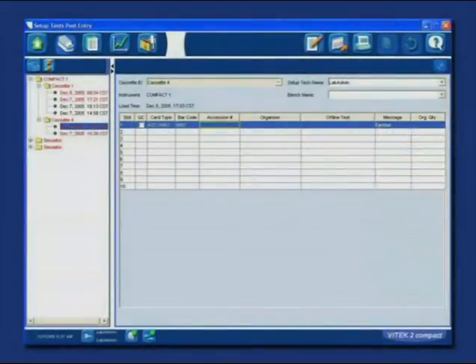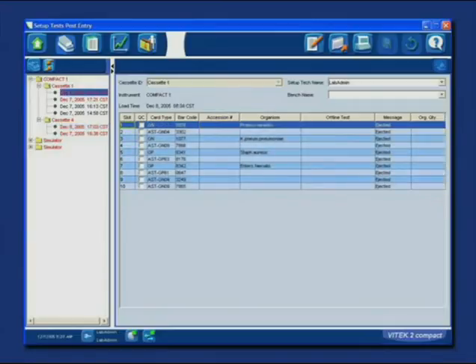To complete data for a single test card, highlight the slot, click on a blank field, and enter data. Complete all fields for that slot.